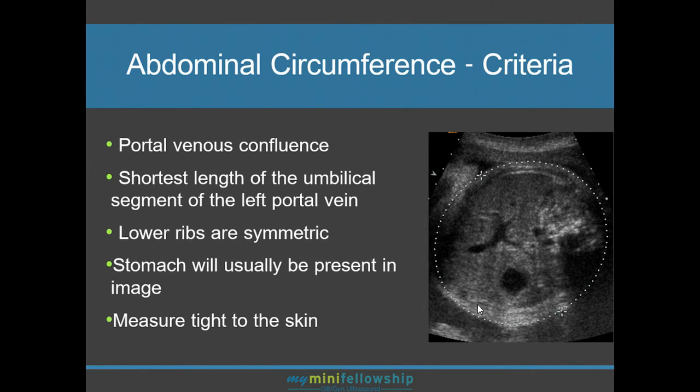Sometimes it can be somewhat difficult down in this area, which is why we're showing this picture here. If you look out here, here's the rib, here's the degree of skin anterior to that rib. Probably should stick to about the same amount posterior to that rib. So maybe this could be a little over measured, but it's hard to say.